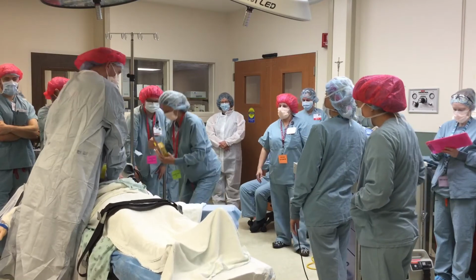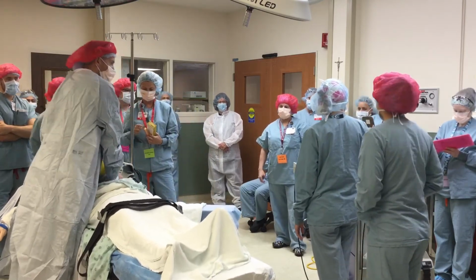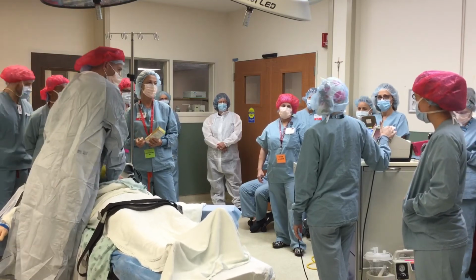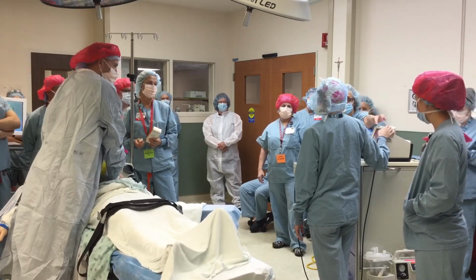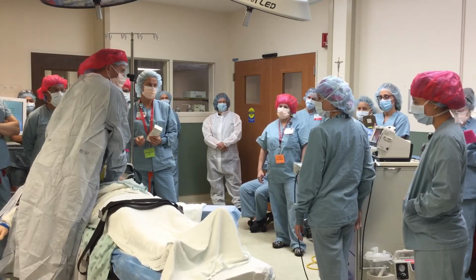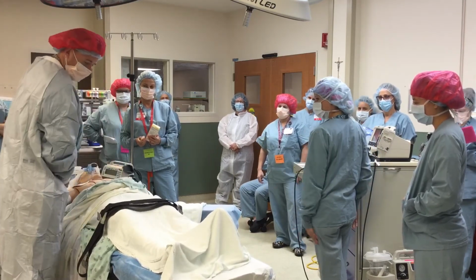All right, let's charge again. Okay, charging at 300. It's a biphasic, 360. You can still do it. Okay, 360. Yep. All right, charging. All clear? All right, clear. Hit the button.